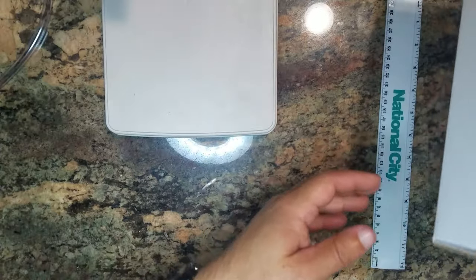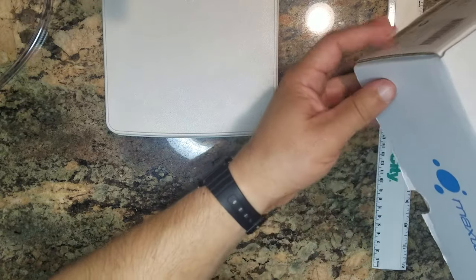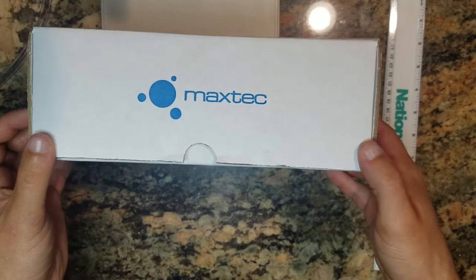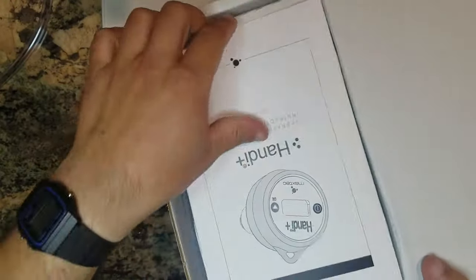This is Alex from Diamond Scientific. Today I'll be showing you the Max Tech Handy Plus, an oxygen analyzer. When you get the box it looks like this, and when you open it up you get a manual.